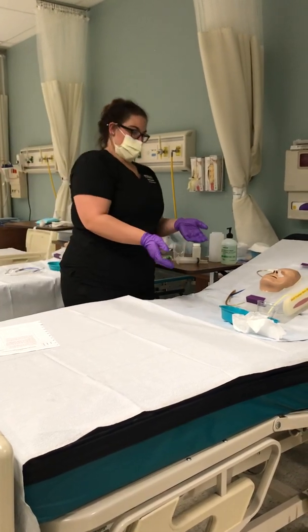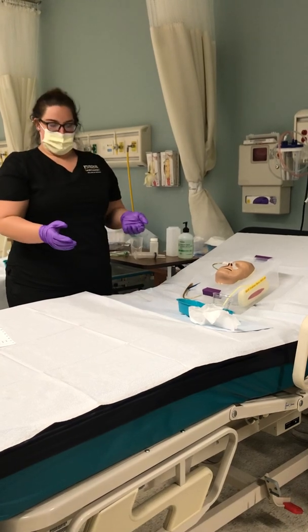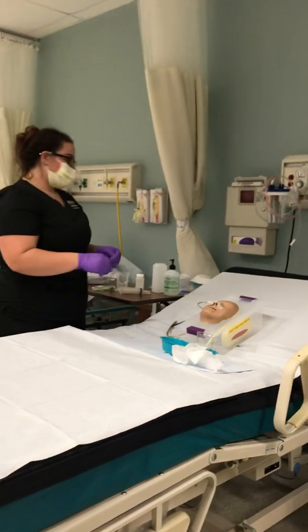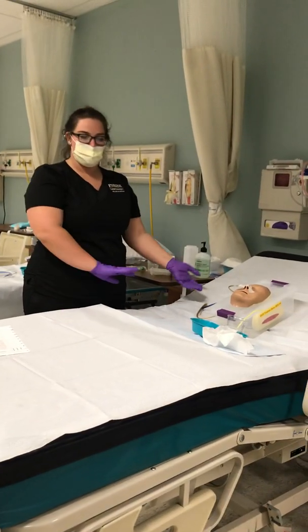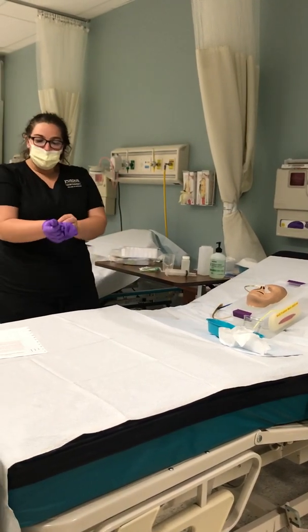So then if they needed anything after this, you would remove all your supplies, see if they needed any oral hygiene, some sort of lip moisturizer or something, and then you would remove your PPE, make sure the patient's back in a comfortable position, move the bed down, remove all your stuff, and then remove your PPE and perform hand hygiene.